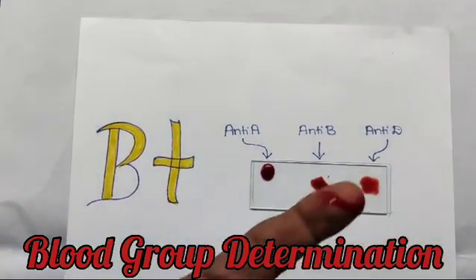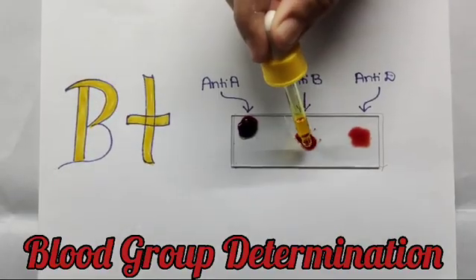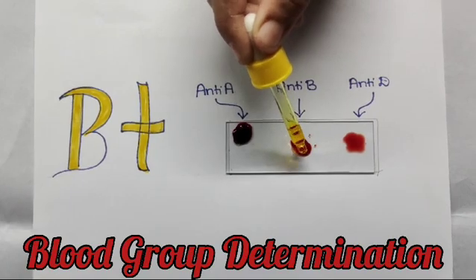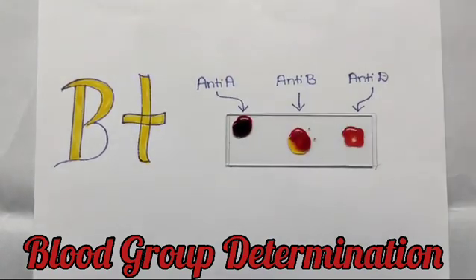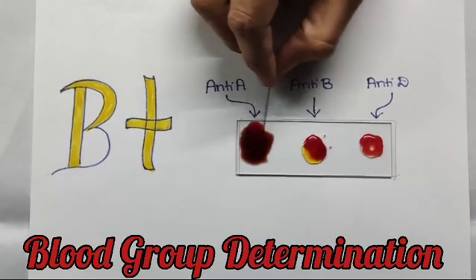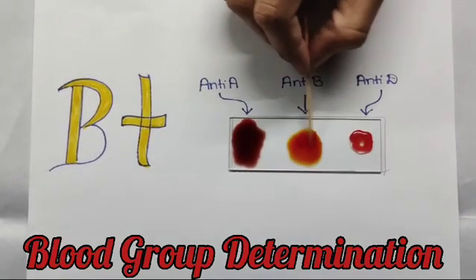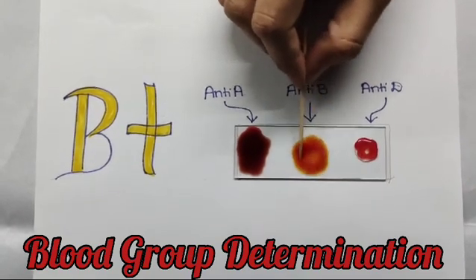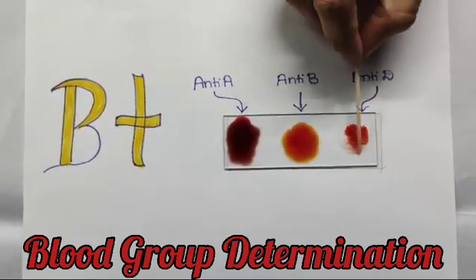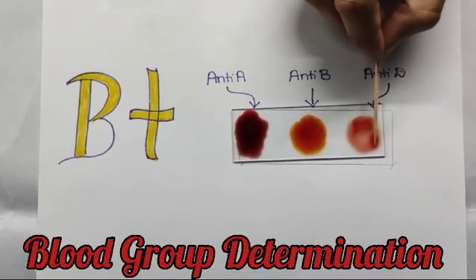First, take a cotton soaked with rubbing alcohol and disinfect your finger. Prick your finger with a sterilized needle. Pour few drops of blood in three parts of the slide and in each pour one drop of anti-A, anti-B, and anti-D.